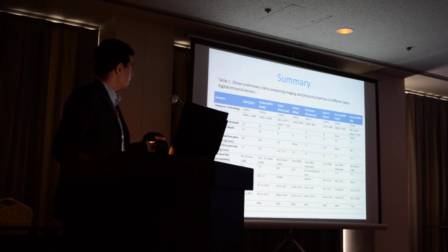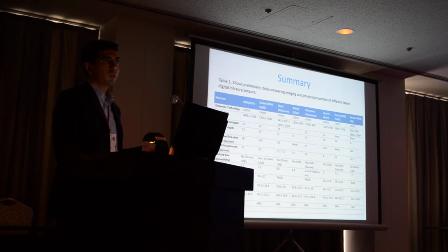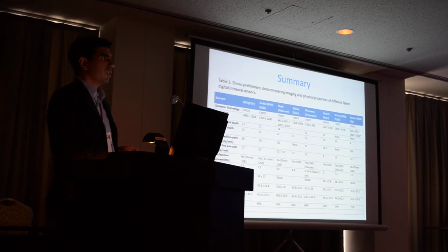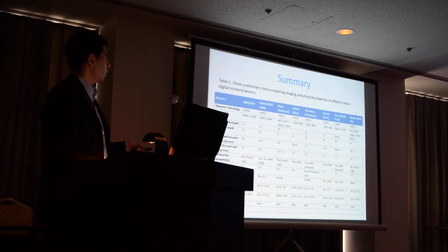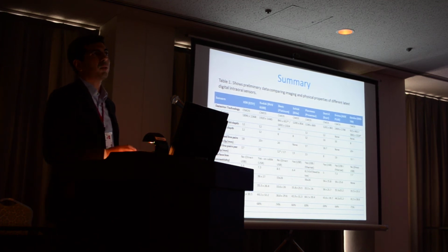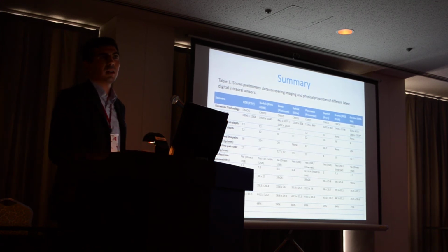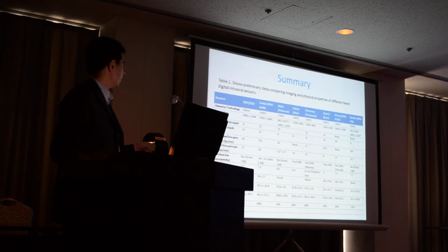Schick sensor was of particular interest, because basically they did not provide any technical specification. We contacted the company and told them we wanted to know the technical specification of their sensor. They said no, nobody should know about that. It's information forbidden from the general public. And basically we used the phantoms to get all the information that we needed.